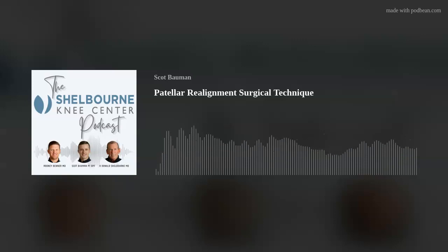We then do a pants-over-vest imbrication by taking the suture from top to bottom on the patella side. So the free end is on the anterior face of the patella, and then we take a longitudinal bite from proximal to distal through the retinaculum, and then come back on the patella side from bottom to top. By doing that, the two ends that you tie together are on the superficial, top side of the retinaculum, and the femoral side is pulled underneath the patella, almost down into the articular surface, and that helps to reduce it back to its anatomical location.